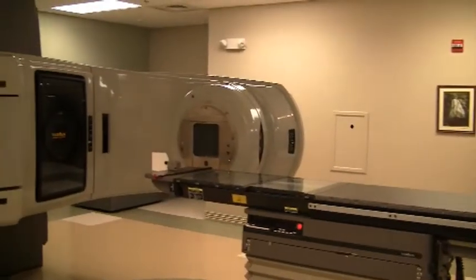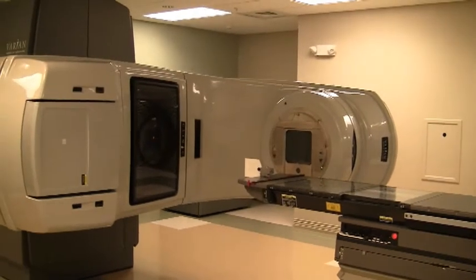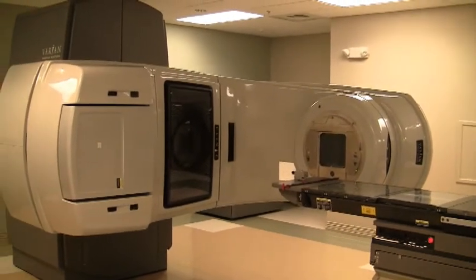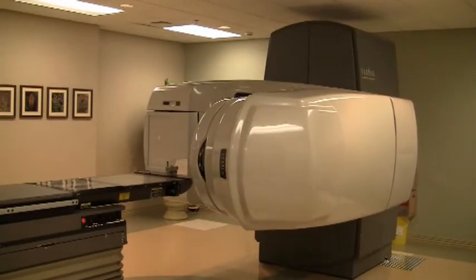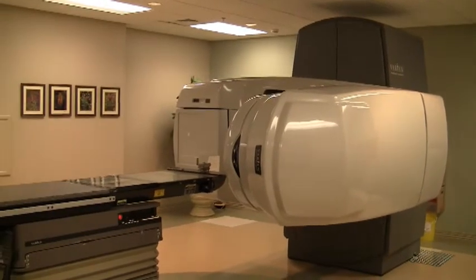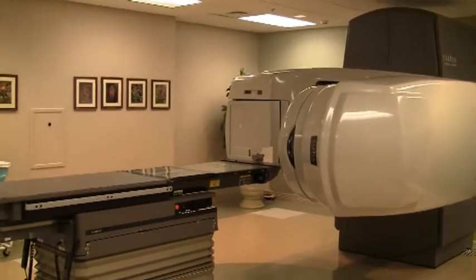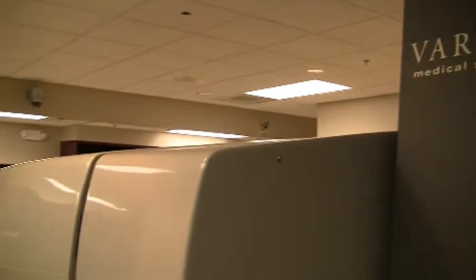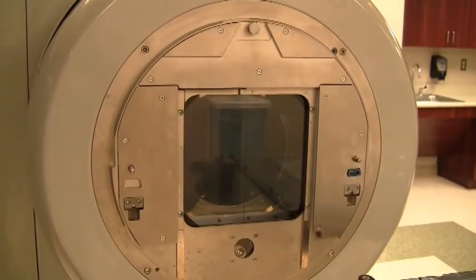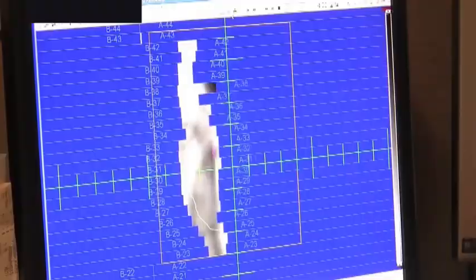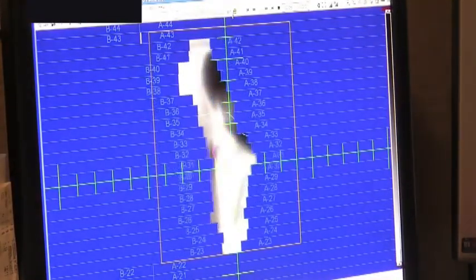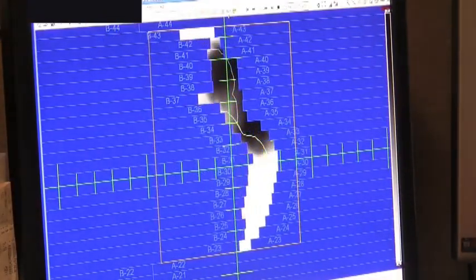Less than a year ago we completed the installation of our newest linear accelerator. This accelerator is as advanced as our older accelerator — they're almost equivalent, both basically top of the line — and have the ability to utilize multiple interlocking leaves. We call that a multi-leaf collimator to shape the field of radiation. There was a time that we had to pour blocks out of molten metal and create these blocks for every patient that we wanted to shape the field.